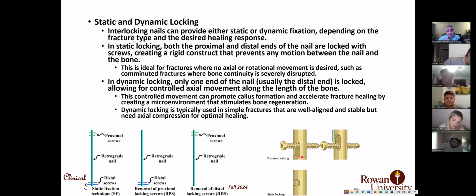The locking mechanisms are the screws, but I will show you some new designs. Instead of a screw, they use nails, or they use very large screws. But whatever they are, they do the job the same as the screws. They can be static or dynamic.